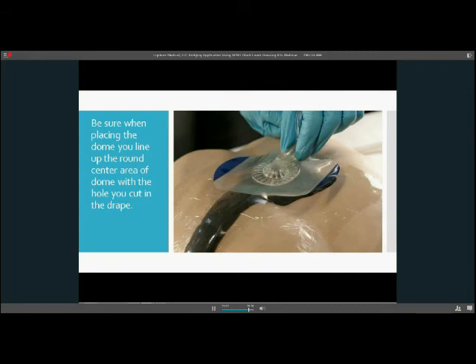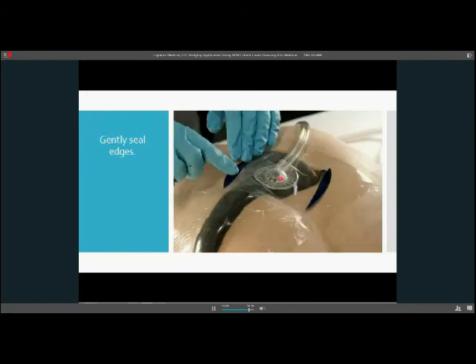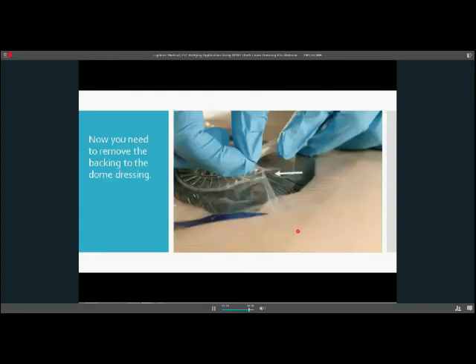If they don't line up, then you may get blockages later. So that's an important step. Sometimes we do things so quick and we may be half off, with only half of it or even more than half lined up, and I've seen that send things off saying there's a blockage. So you want to be sure when you're placing your dome down that you're actually centering it over. Again, you're just going to place it here.